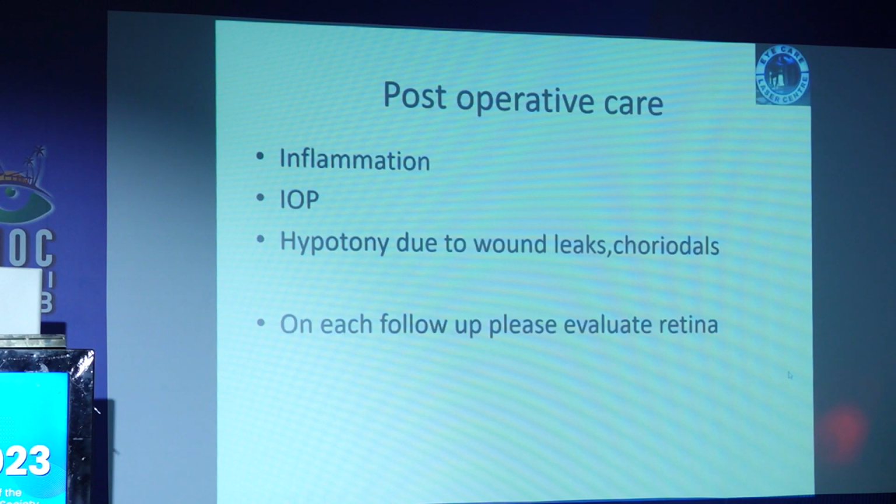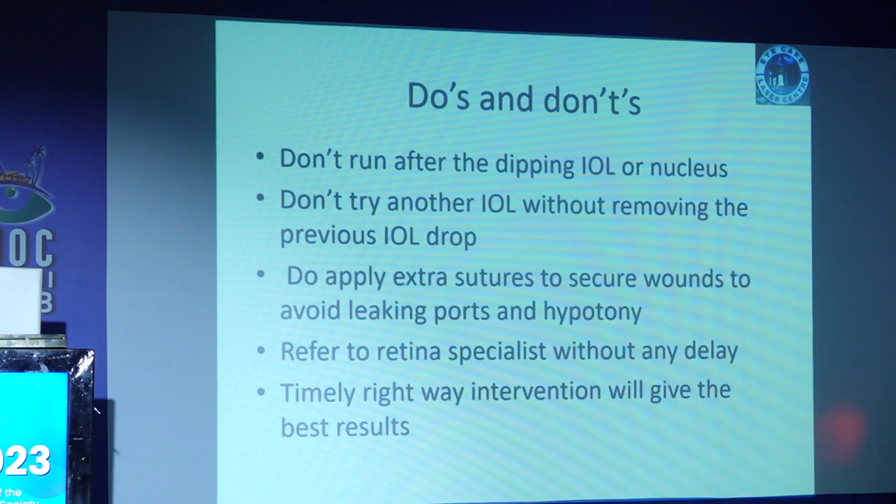Post-operative care is inflammation, IOP, hypotony due to wound leak, choroidals. On each follow-up, please evaluate the retina. Do's and don'ts: don't run after the dipping IOLs or the nucleus, because I have seen removing an IOL even lying buried into the retina. So they are running after the IOL, then pressing the IOL and damage the retina, leading to detachment. Don't try another IOL without removing the previous IOL. I have seen that also, like one IOL already lying in the vitreous cavity, another IOL placed in the sulcus.